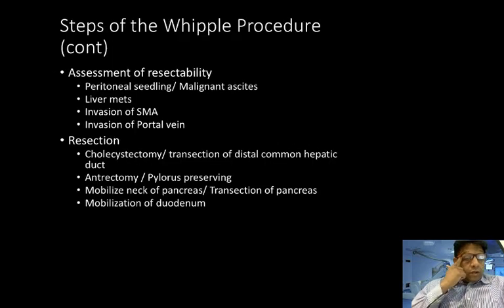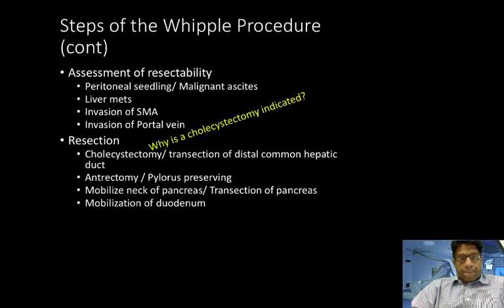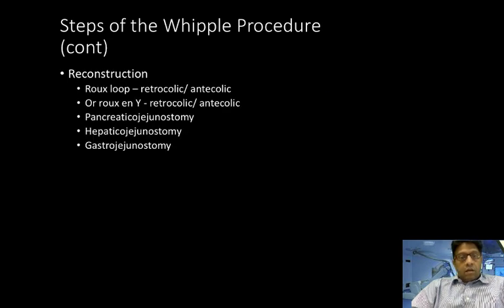Thereafter, we've already alluded to this. This is a good question. Why is cholecystectomy done in this procedure? It would be possible to do a choledochojejunostomy. Okay, please think about that answer. We'll get back to it.